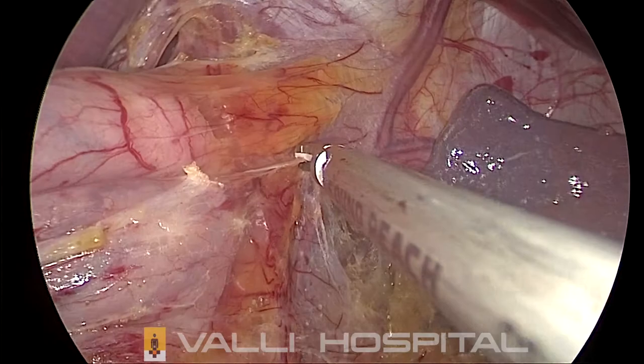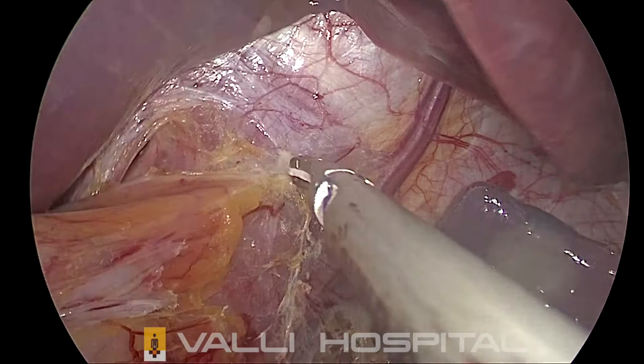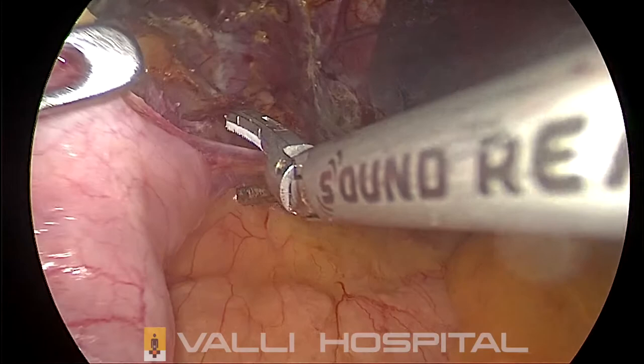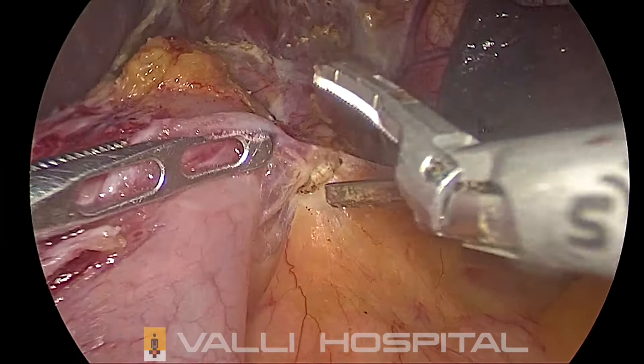Now we are dissecting over the left crus. You can see the fat. You move the fat towards the stomach or the esophagus. Part of blunt and part of sharp dissection. All this dissection must be done in an avascular plane. If you cause a lot of bleeding, you will have a lot of difficulty in finding which is the nerve and which is the pleura, and you will have difficulties.